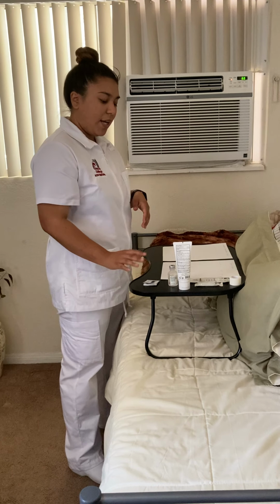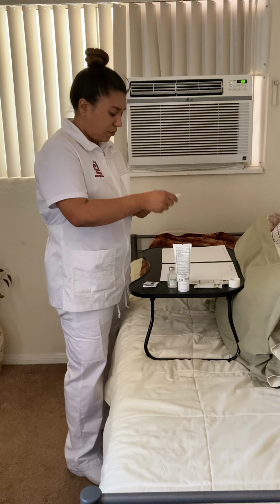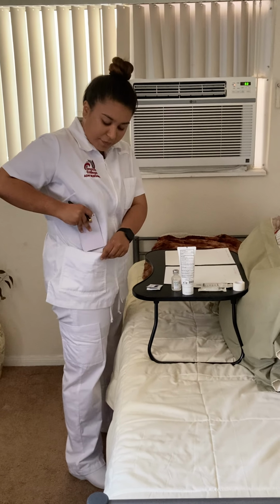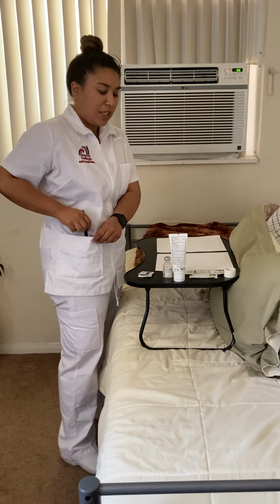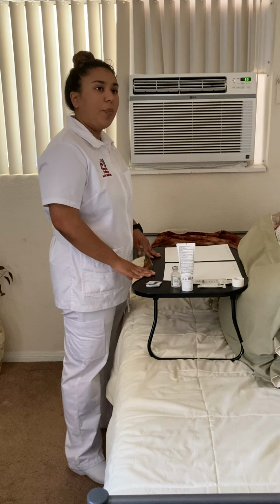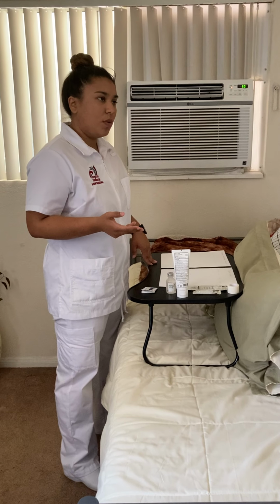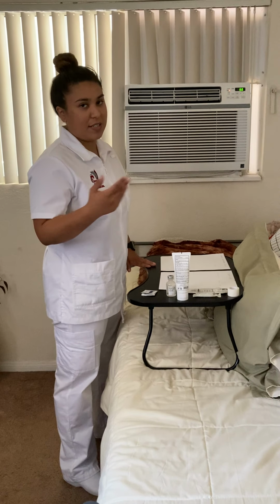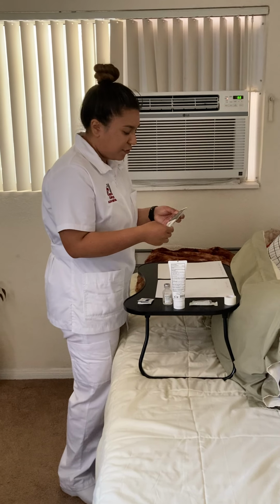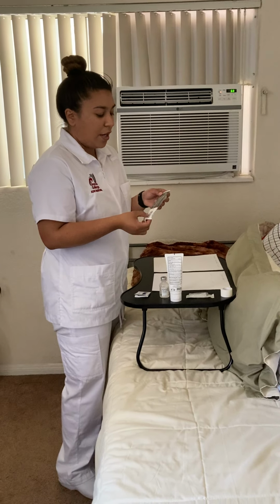After I've done that, I'm going to go ahead and perform the dosage calculations to determine the correct amount. So I would do my dosage calculations, and then after that I'm going to select the appropriate syringe and needle. So this is going to be an IM injection, so I want to select a 22 gauge needle. A 1 inch would be fine since my patient is a normal build, and I'm going to select a 3 milliliter syringe again because this is an IM injection. So I have that here. I'm going to have to switch out the needle later on because this is a 3/4 inch needle.